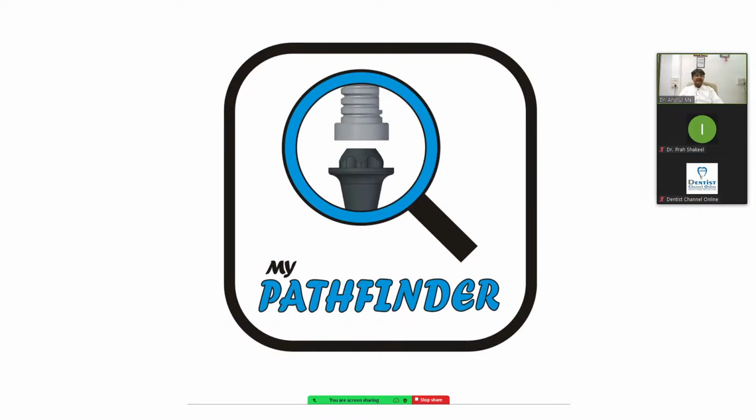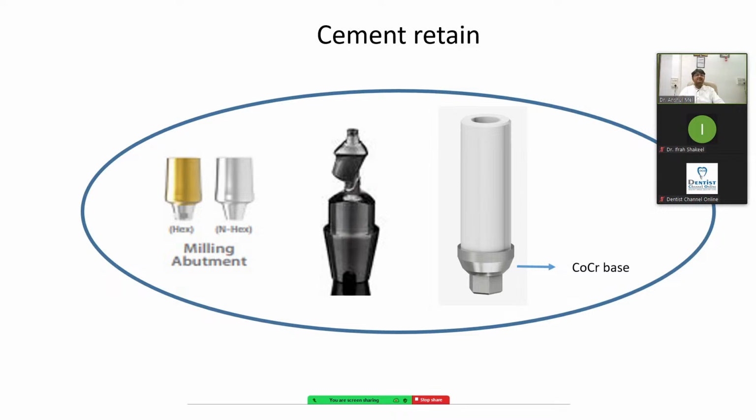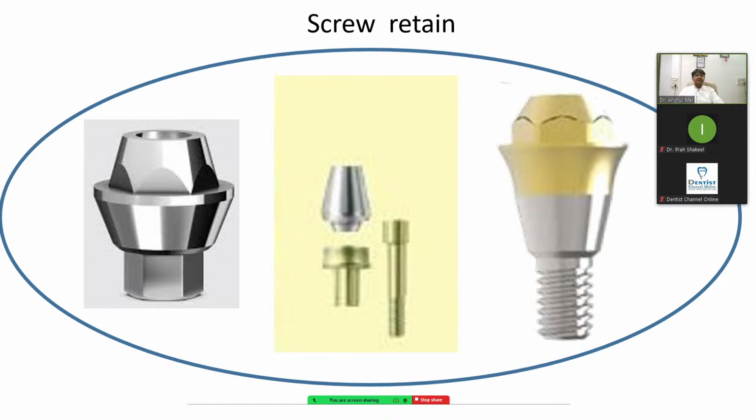So for that, Pathfinder is one of the solutions. I will discuss the later part of that solution later. But in the basic, if I have a cement-retained, I will select these three most common solutions, and the screw-retained. I will use these three common solutions to get my patient work done easily.